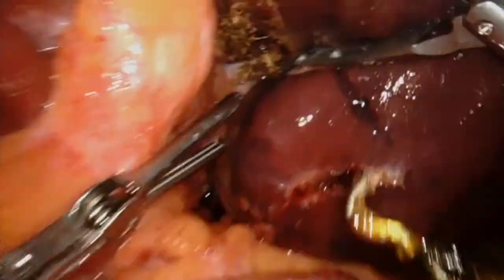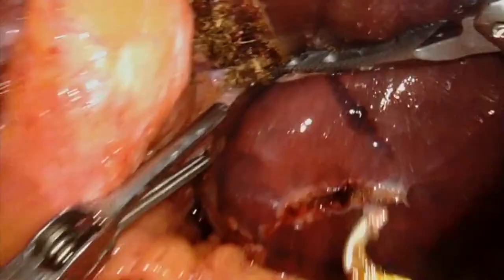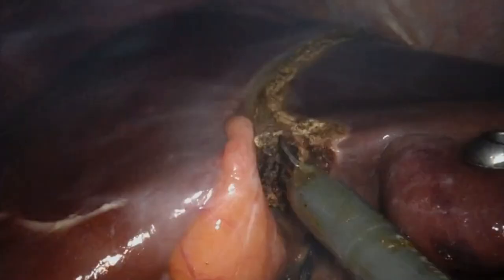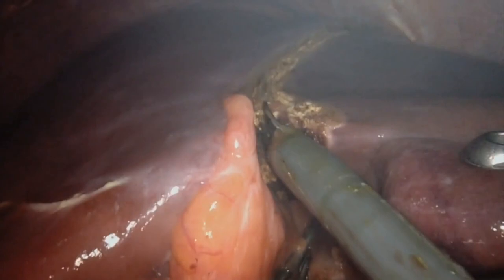In order to minimize bleeding, we utilized inflow vascular control using straight vascular bulldog clamps. One was placed on the left portal vein and one was placed on the left hepatic artery branches supplying segment 2 and 3 of the liver. Once inflow control was completely obtained, we started the liver parenchyma transection.